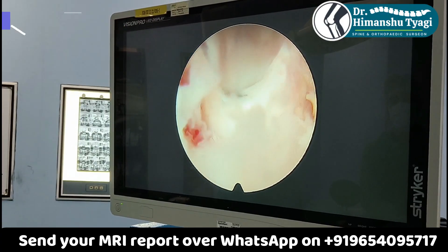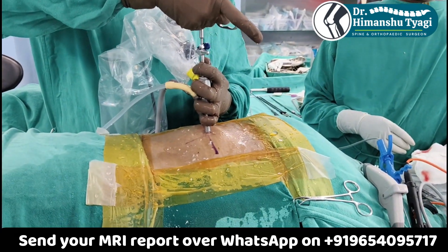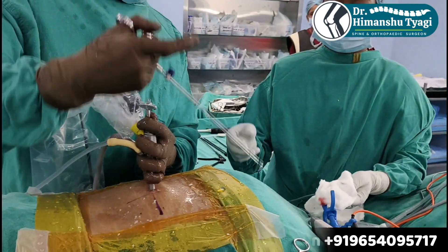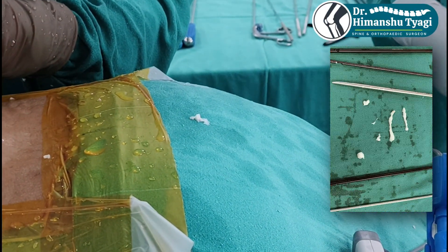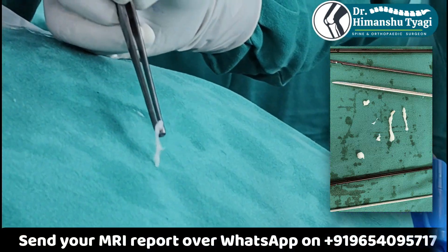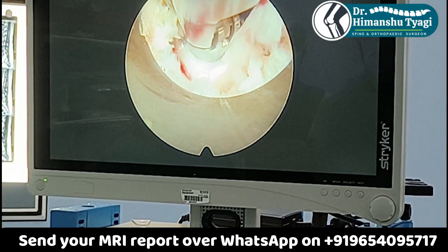We take those fragments out. Sometimes the fragments are big, sometimes they are small, or it can be one huge single fragment. In this case we are removing multiple fragments to debulk the part of the disc that is pressing the nerve. Normally the disc that comes out is like wet cotton — as you can see here — and we will be removing multiple pieces before the nerve is fully free.